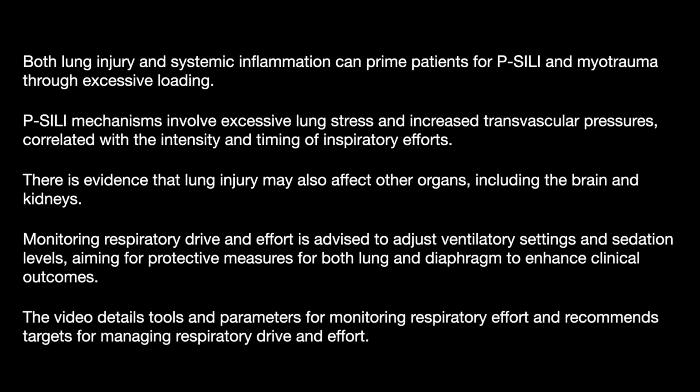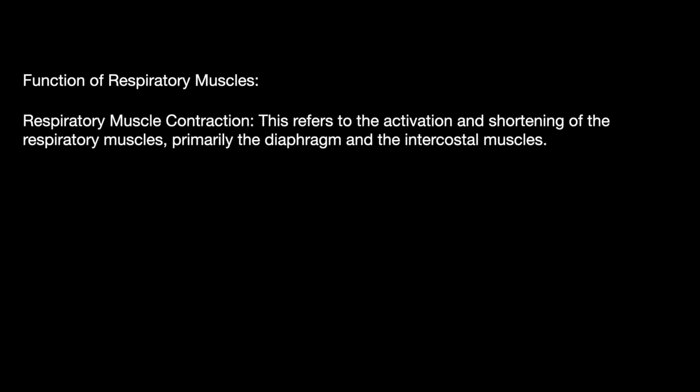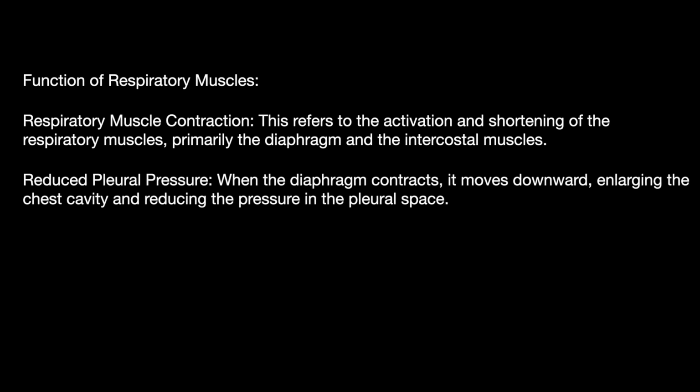This particular video details tools and parameters for monitoring the respiratory effort and recommends targets for managing the respiratory drive and effort. So coming first to the function of the respiratory muscles. The main function of the respiratory muscle is the contraction. This refers to the activation and the shortening of the respiratory muscles, mainly the diaphragm and the intercostal muscles.